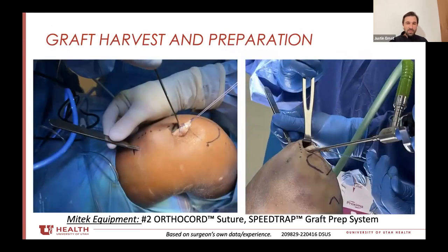I've got the graft completely released and I'm ready to get it out of the knee. With an army-navy retractor and looking down the incision, most of the time it's just pure visualization with my own eyes — I don't need the camera — and it should release out of the wound.